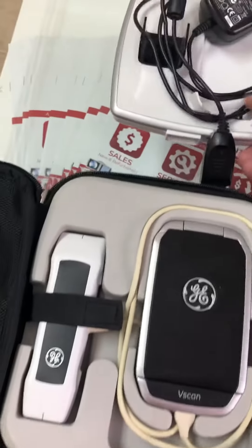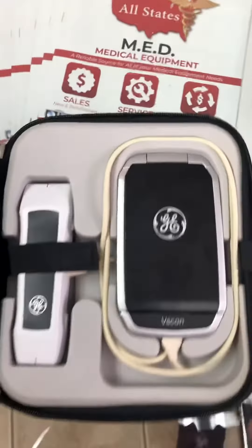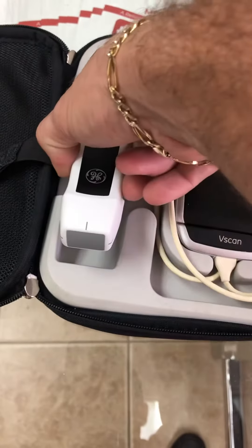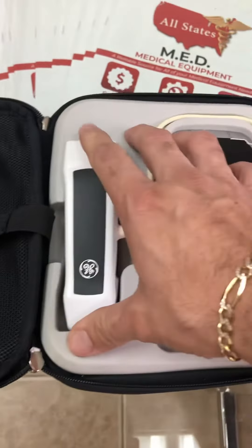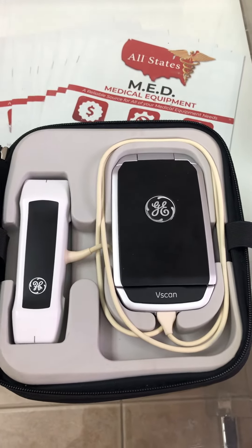We have 65 of these units in stock here at All Statesman. These units are in perfect condition and come with warranty. You have the Dual Probe with deeper tissue and lower extremities, so it can be used for a variety of different applications from OBGYN to cardiac, vascular, musculoskeletal, and more.